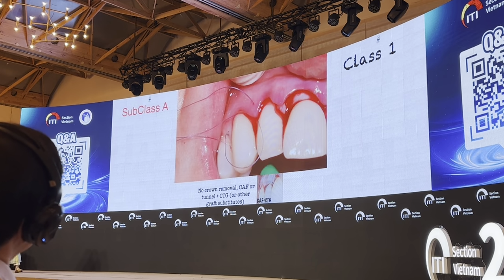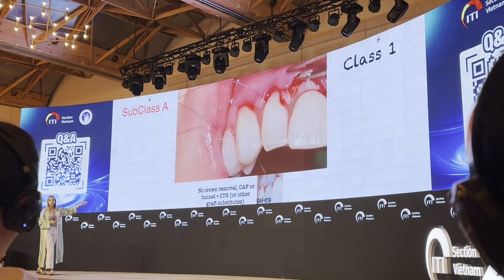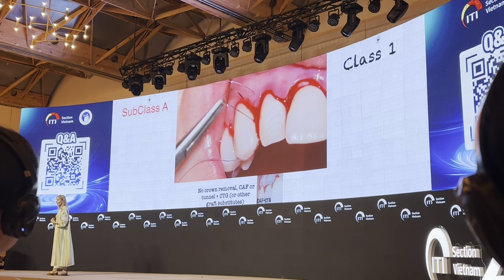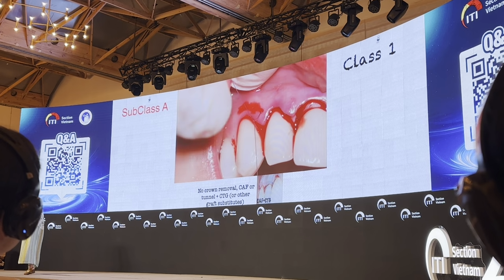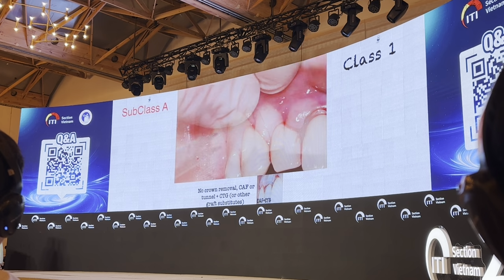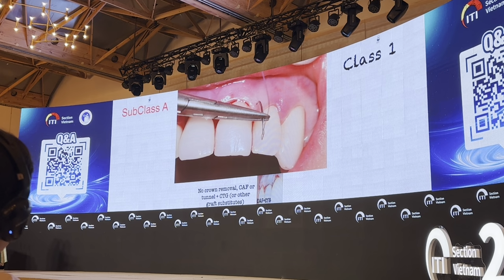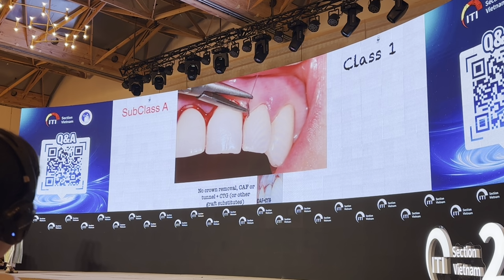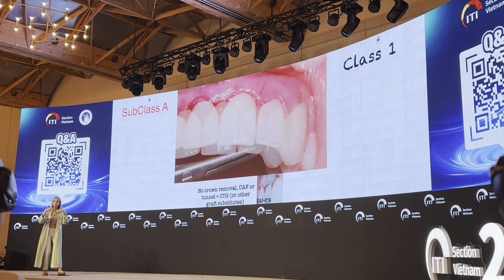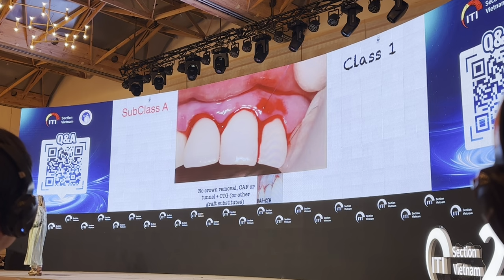And now I coronally advance my flap. I was able to remove all the muscle insertion from the inner aspect of my flap. I have performed the frenectomy from inside, removing through the deep and the superficial split thickness incision the muscles in between, that were the muscles that belong to the frenulum, in order to remove all the tension and to obtain a flap which is passive.